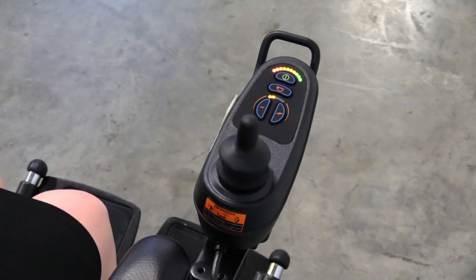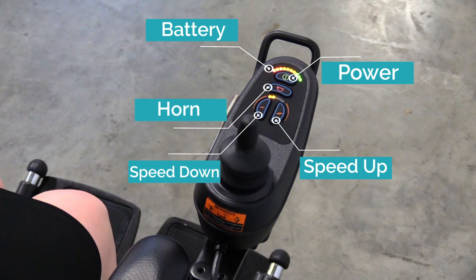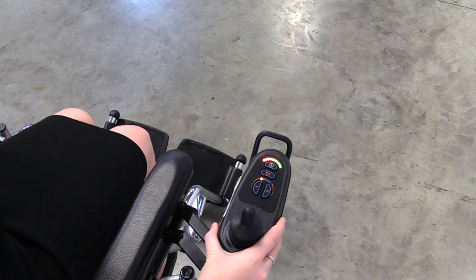Your Puzzle has a user-friendly control panel that has a power button, speed increase and decrease button, battery gauge, and a horn. Your control panel can swing back to allow closer access to a table.